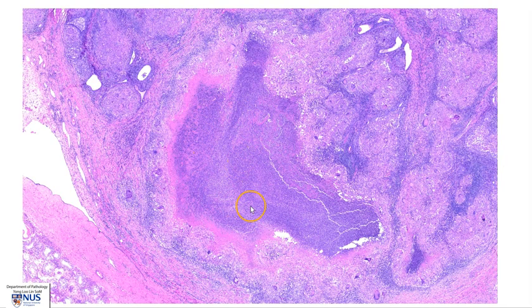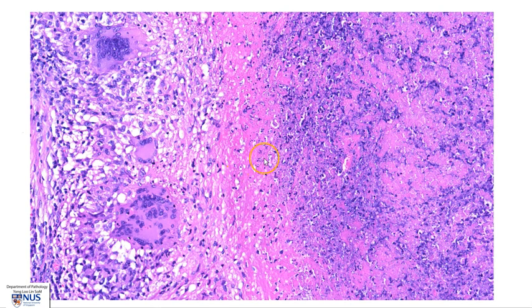Here is an area of necrosis that is surrounded by granulomas. This is a high magnification view of the necrotic area with pink eosinophilic amorphous material and lots of karyorrhectic material. We have some multi-nucleated giant cells and viable epithelioid histiocytes surrounding the necrotic area.